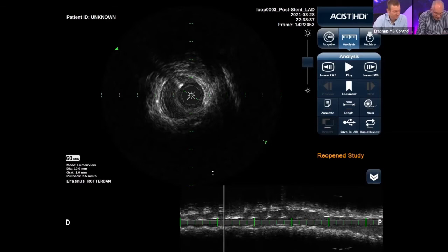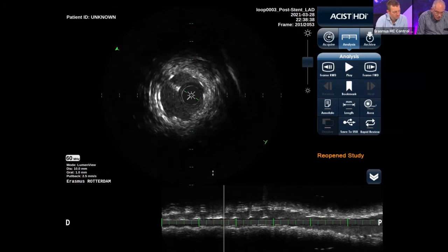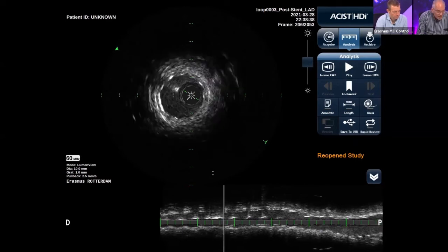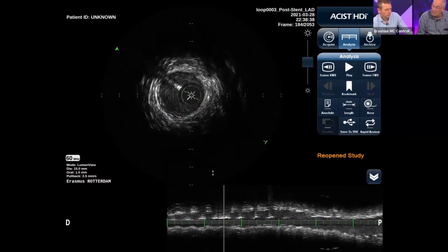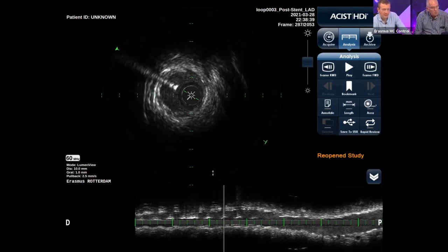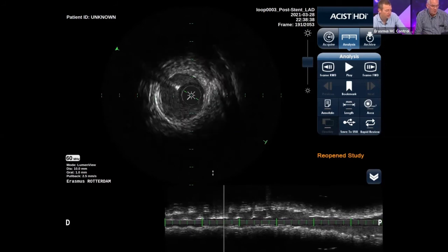But anyway, we go first to the distal stent edge, and then we can check for edge dissections. And this is how you do that. You let it move up and down, and then you check all around if you see disruptions in the plaque, a tear in the plaque, and like that. Now, in this case, even if I have my correct glasses and I look at this big screen there, I don't see any disruptions there. So there's no edge dissection at the distal edge. Plus, what is important is that we could confirm here with the IVUS that we landed in a very healthy reference segment.